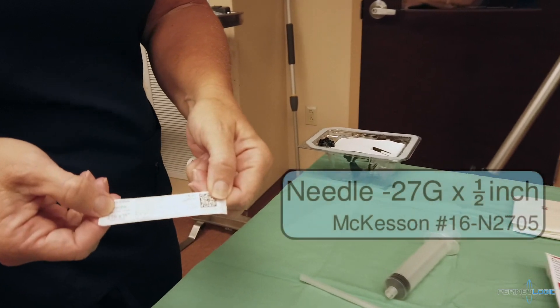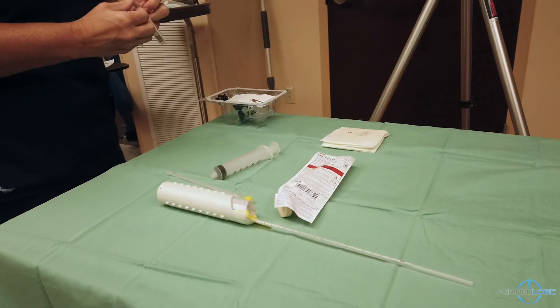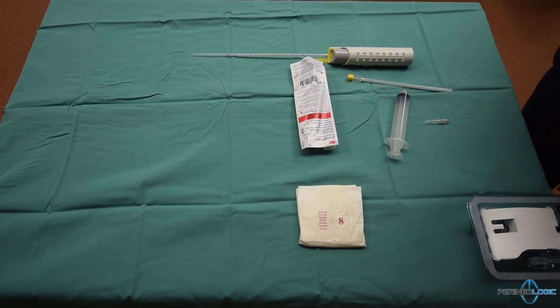Also, we obtain a 27 gauge needle, half an inch in length, and this will be used to inject a skin wheal at the site of entry of the access needle.